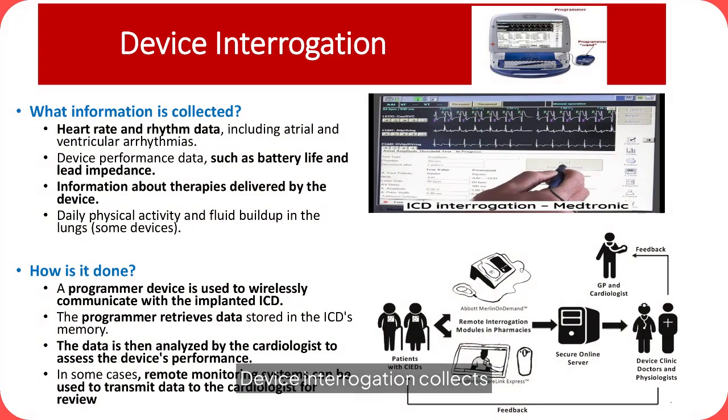Device interrogation collects data on heart rate, rhythm, and device performance. A programmer communicates with the ICD to retrieve and analyze data, ensuring optimal function. Remote monitoring can also be utilized for ongoing assessment.